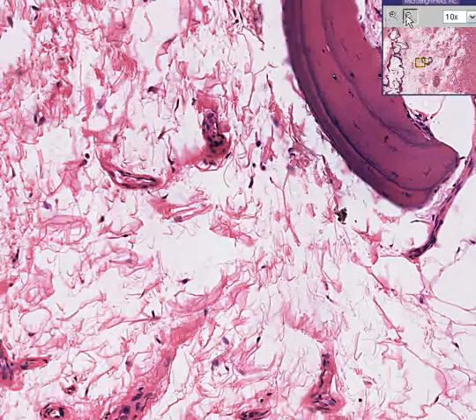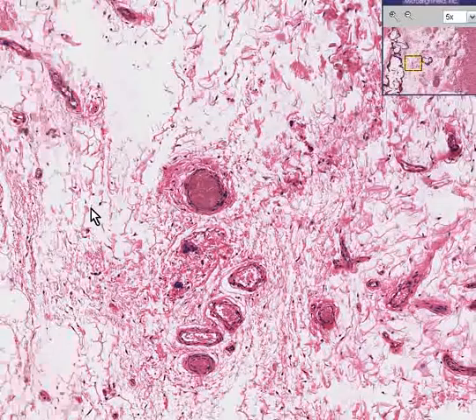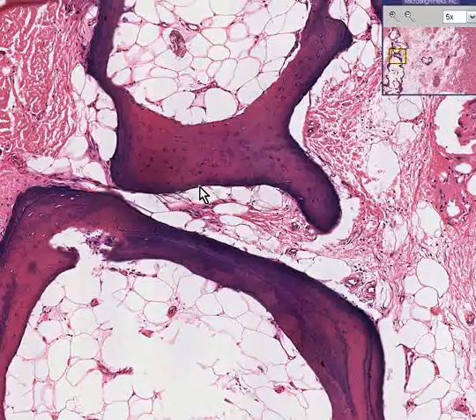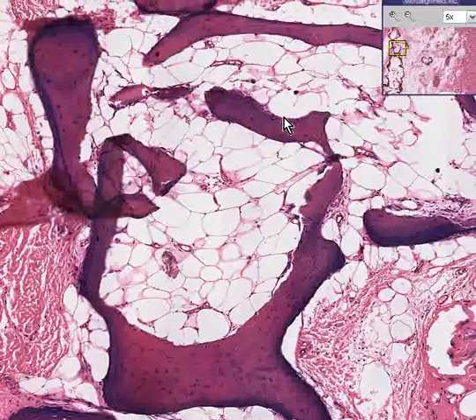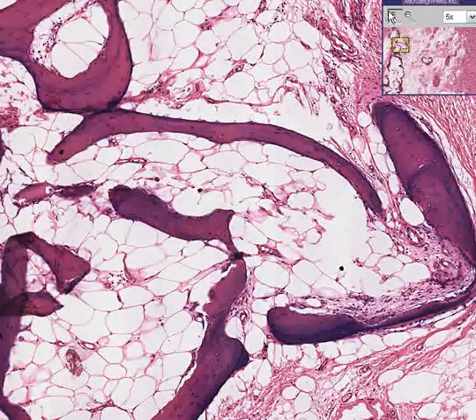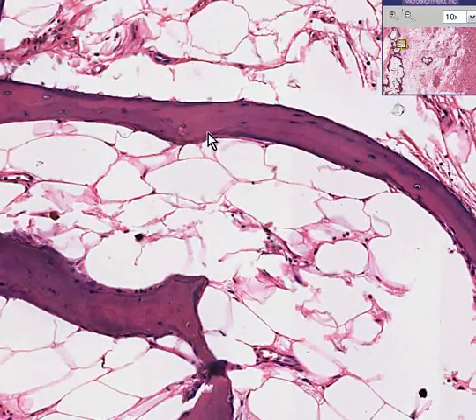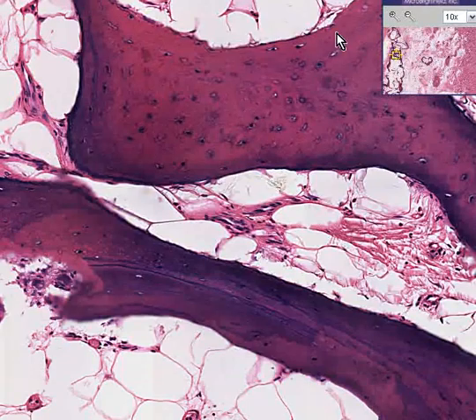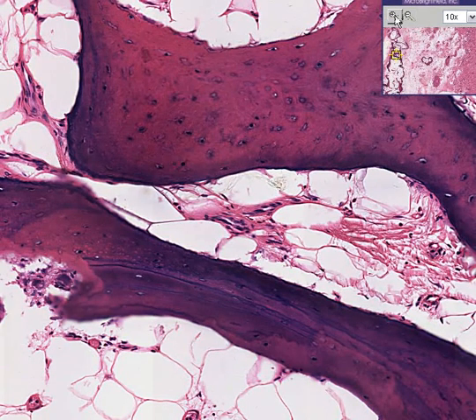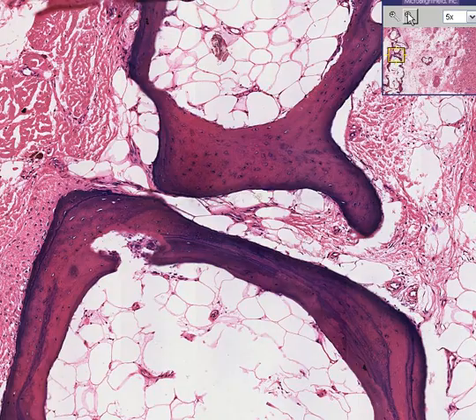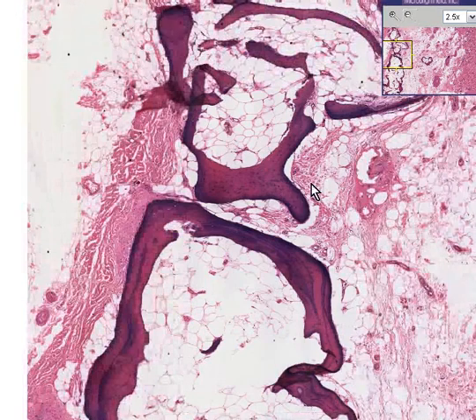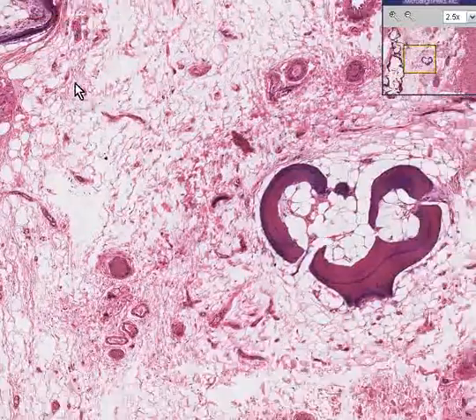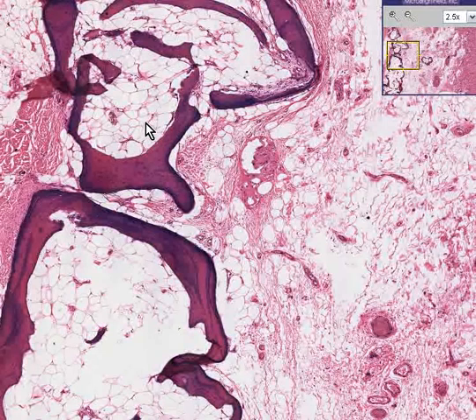If we keep moving a little bit, we will see that there is another area of bone as well. You're asking yourself: what is this histologically normal-looking bone doing in skin? Well, this disease is called myositis ossificans, and myositis ossificans is a metaplastic process in which normal bone replaces normal soft tissue.